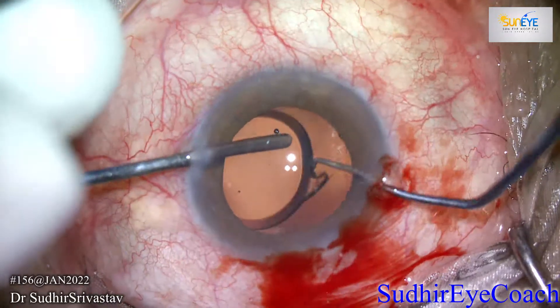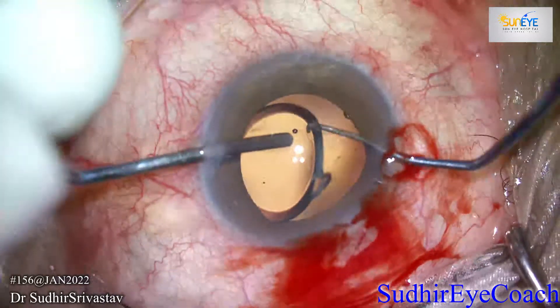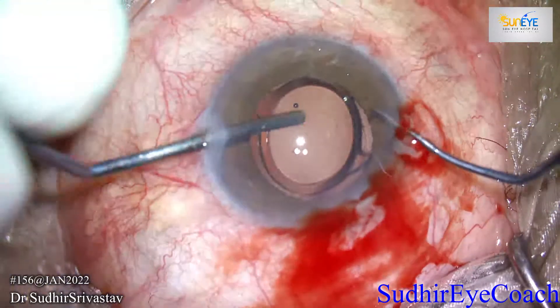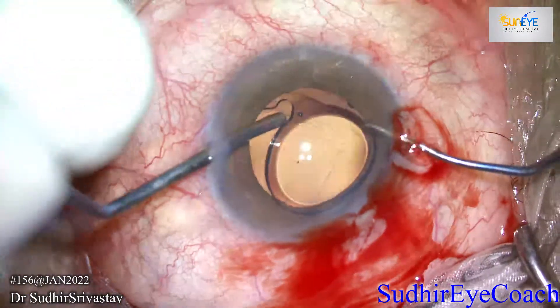When I dialed the IOL, I found one haptic was missing. Due to this defective haptic, the IOL had descended. So I decided to remove the IOL and implant a fresh new intraocular lens. Carefully, I dialed the haptic out from the bag.